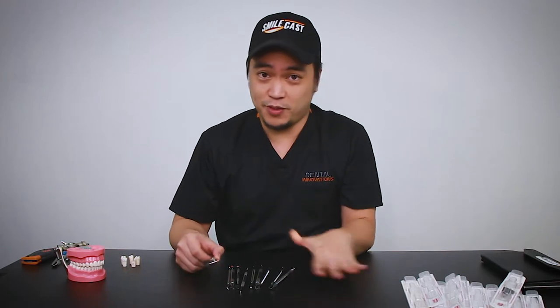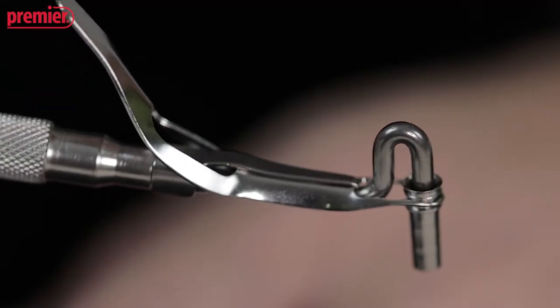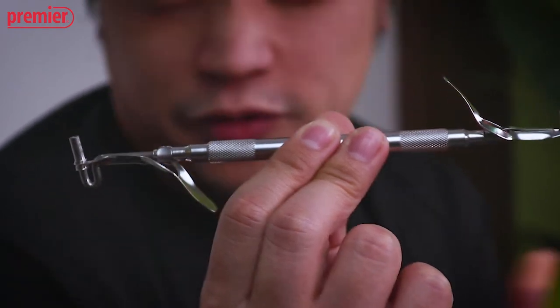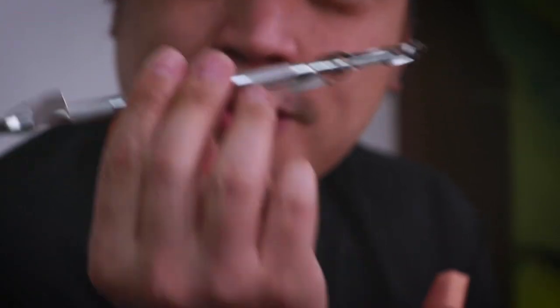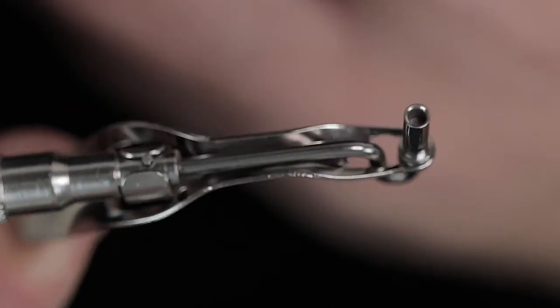I'm gonna start with the biggest instrument we have here, which is the amalgam carrier. What I love about this is the fact that it feels so solid. In dental school, there are a lot of amalgam carriers that feel a little bit flimsy — I've broken mine because they just feel so flimsy. This one feels very stable. As I'm pushing that, I know my amalgam is gonna get packed well.